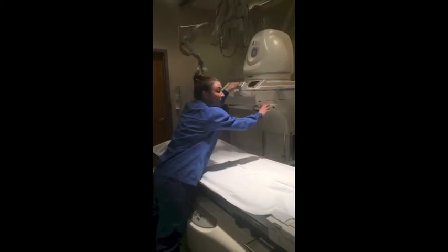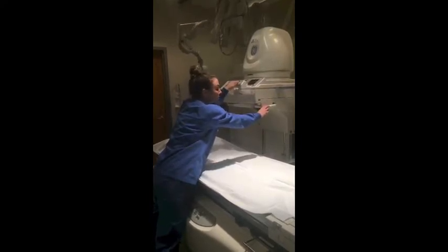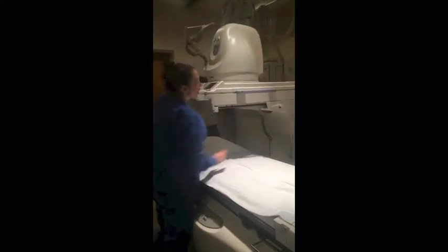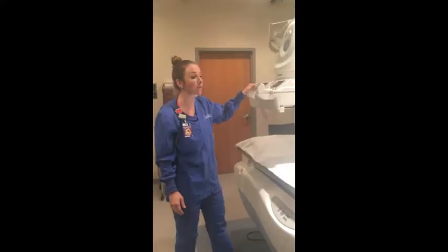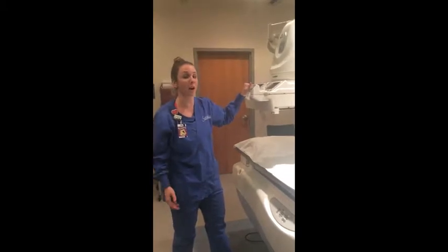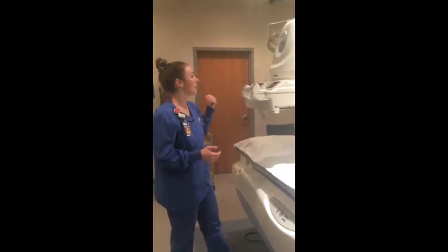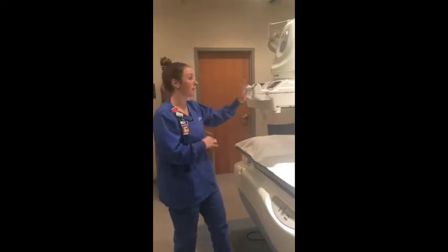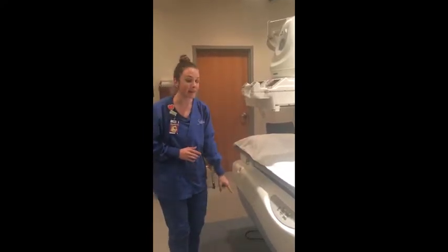But when you're ready to start the procedure, you'll depress the switch down and pull the tower all the way over the patient, and that's what's going to allow the radiologist to start and stop the fluoro. Okay? Those are really the main operations of the fluoro tower, table, and dead man switch.